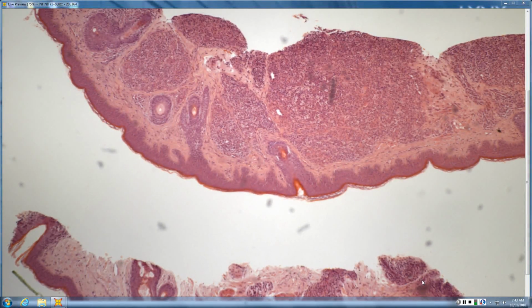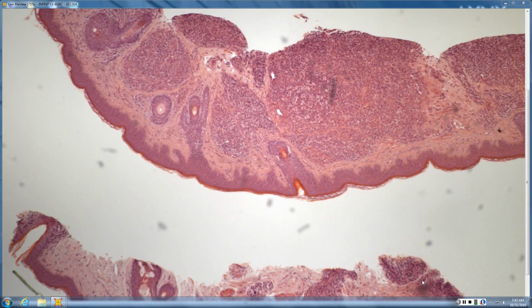If it were extensor skin, EED. Yeah, they're pretty much the same. The difference is EED, just because of where it is, you tend to get more onion skinning of vessels over time. Facial skin just isn't prone to that. Granuloma faciale, you tend to get more hemosiderosis over time. EED, you get more cholesterol building up over time from all those erythrocyte membranes that are left behind. But otherwise, they're sort of variants of the same process.